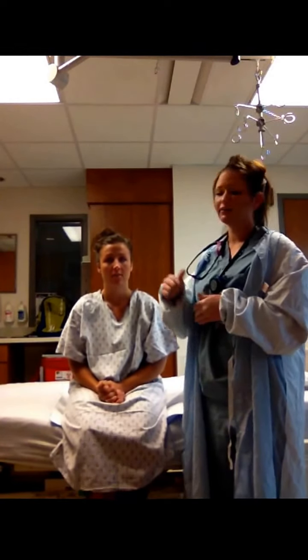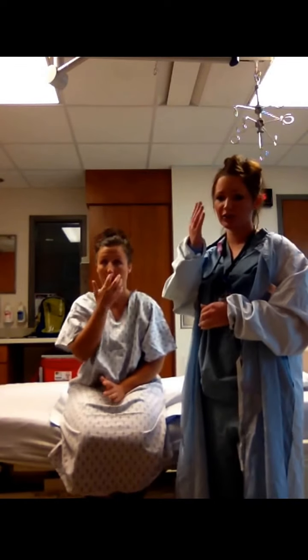For today's purpose, we will just explain the Snellen chart since we don't have one available. If I was testing Courtney's vision with the Snellen chart, I would place the chart on the wall. I would have measured out 20 feet and have Courtney stand 20 feet away from the chart. I would first have her cover up her eye, not with her fingers, to avoid any kind of maybe seeing through the fingers. I would give her an opaque card. She would stand in front of the Snellen chart 20 feet away.